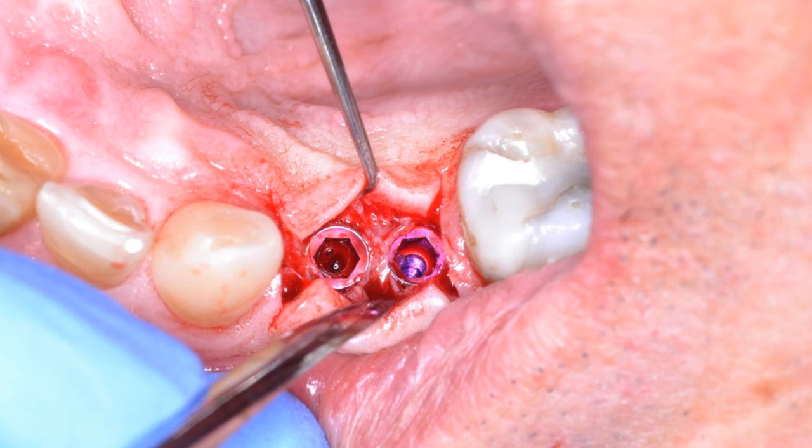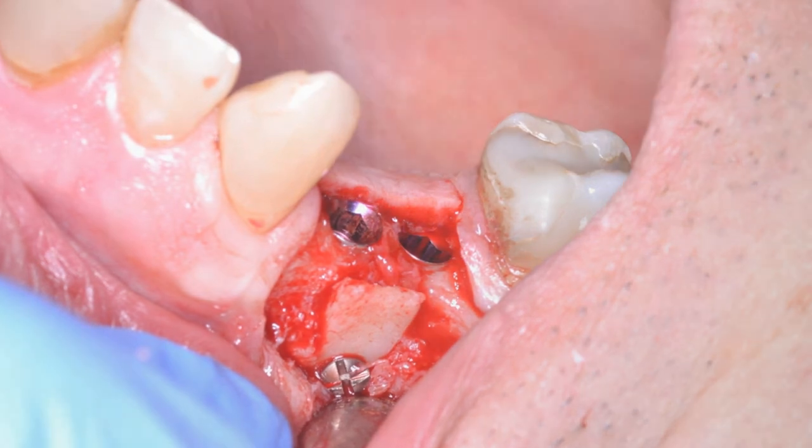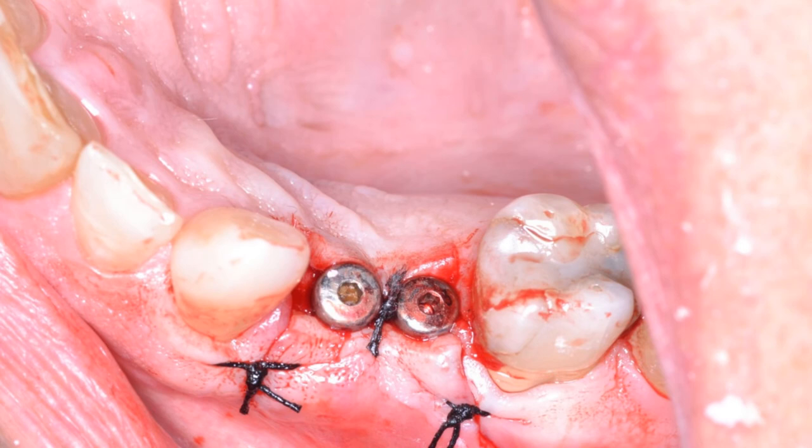We removed that screw from this patient and put some healing abutments down, a couple stitches inside there, and you'll see when this patient comes back that that's what the patient looks like. You can still see the outline of that H incision, but nonetheless, it's healing nicely. And we remove these healing abutments, and just take a look at that tissue. Wow, that looks really nice, right? Trust me, it still looks like that right now. This case is from 2 years ago.